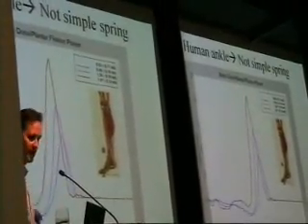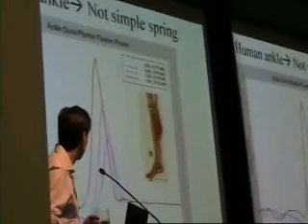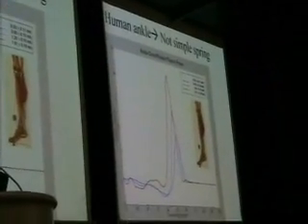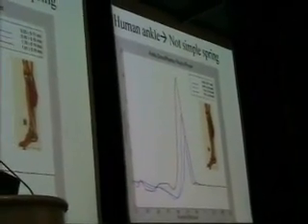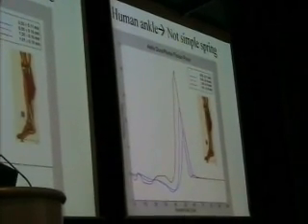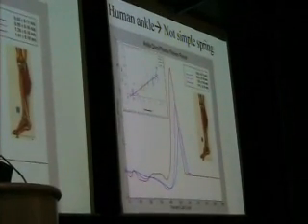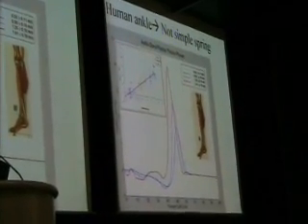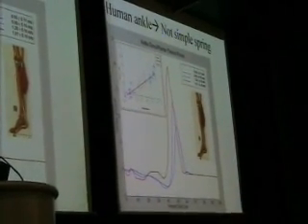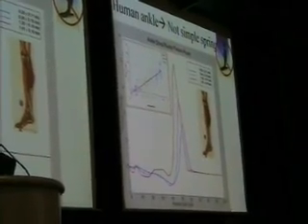So this is how your ankle works. Here's mechanical power plotted vertically, and percent gait cycle plotted horizontally. There are four curves corresponding to four different walking speeds. It turns out when you walk faster and faster, your ankles give out more and more energy, more energy than a spring can provide. And conventional prostheses obviously can't provide those human-like energies.